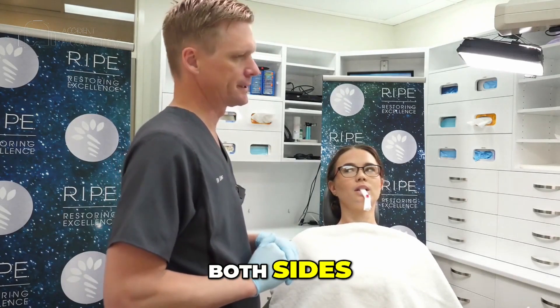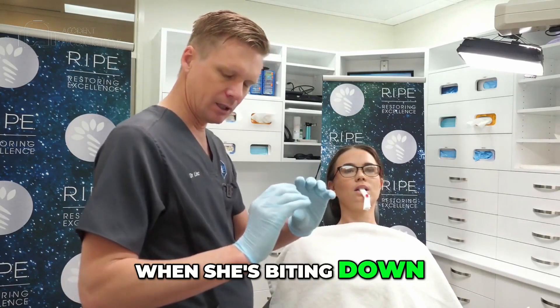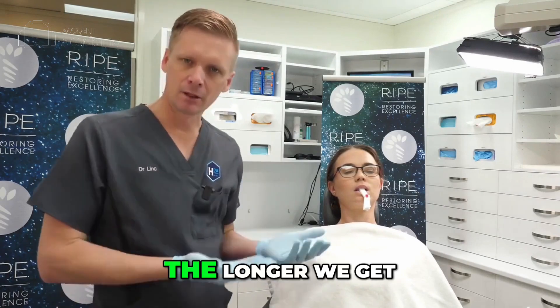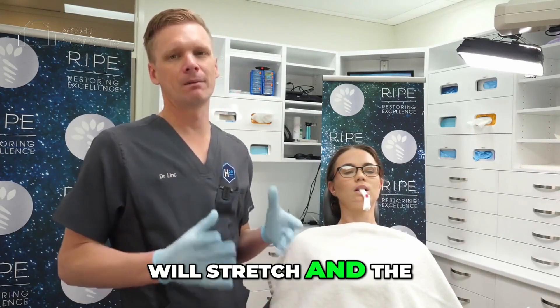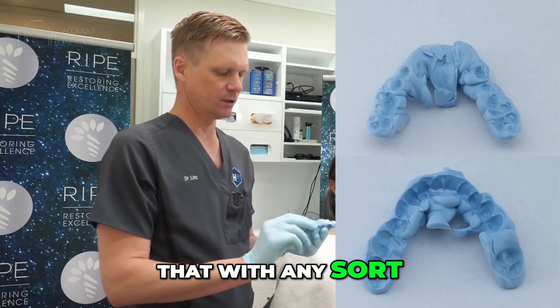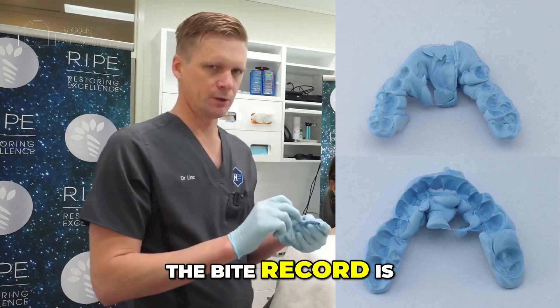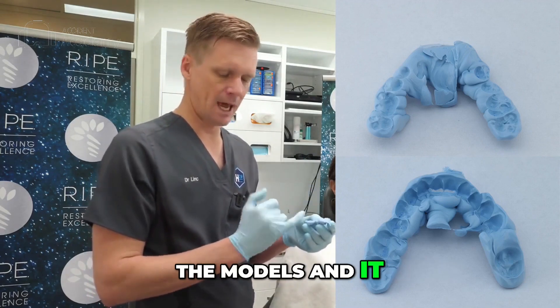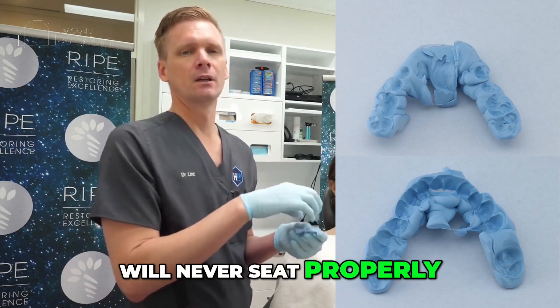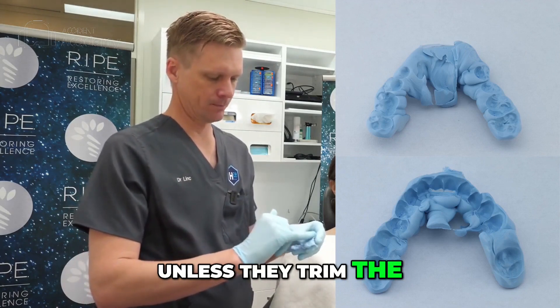A little bit. Both sides. So at the moment our patient, when she's biting down, the lateral pterygoids are getting some stretch, so she's getting a little bit of tenderness either side. Obviously, the longer we get her to sit here, the more those muscles will stretch and the better the bite we will get. You also need to remind the technician that with any sort of bite record, they need to trim the bite record before they seat the models, because the bite record is always more accurate than the models and captures the fissure details really accurately, which means the models will never seat properly unless they trim the bite record down.